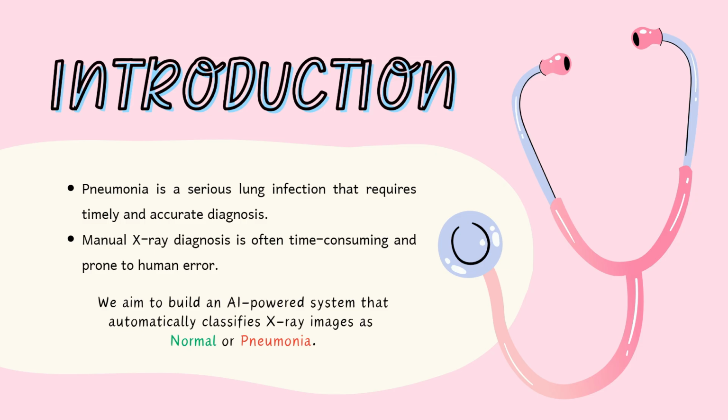Pneumonia is one of the leading causes of death in children and elderly patients worldwide. Diagnosis requires chest x-rays, but here is the challenge. Manual diagnosis takes time. Radiologists can be overworked or simply unavailable in remote areas. And even experienced doctors can sometimes miss subtle signs. That's why we built an AI powered solution to help doctors make faster, more accurate decisions.